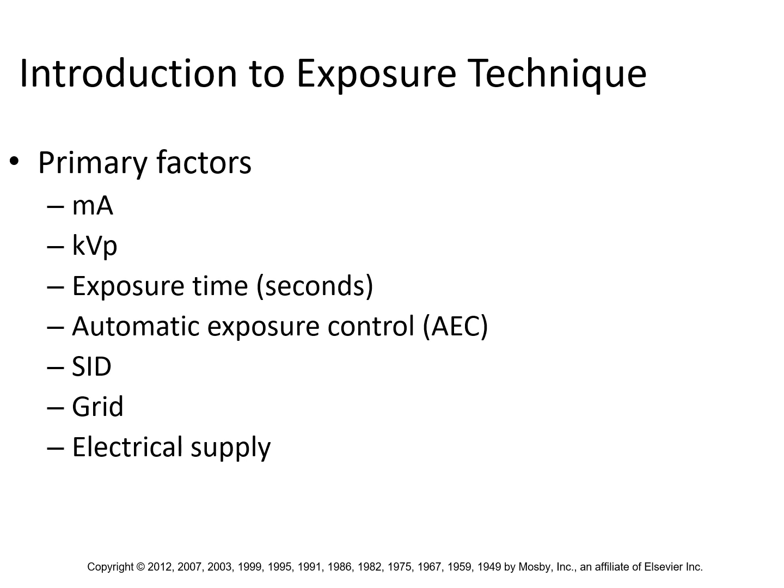Okay, pretty straightforward. A deeper dive, yeah, your senior year, that's when you go into a deeper dive. You can read about that in Bushong if you're just curious, but you really don't need to know more about AEC until you're almost ready to pass the registry. If you understand that it's an automatic kill switch for the exposure that's based on a radiation sensor in the image receptor apparatus, that's all you need to know for practical applications and performing exams.